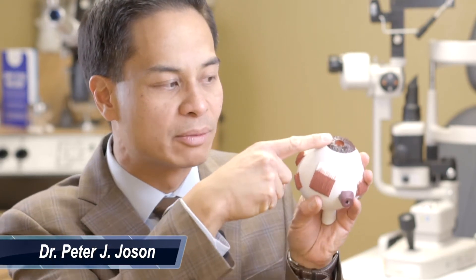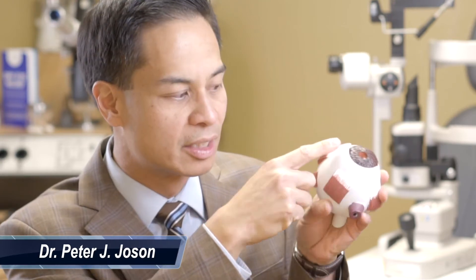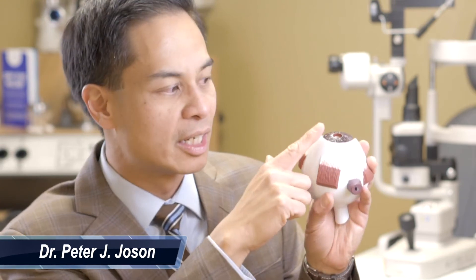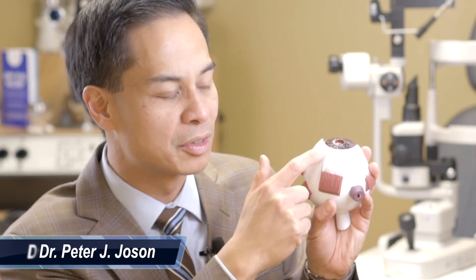During the surgery, you'll be on your back. There'll be a microscope placed over your eye to direct my vision and my hands to the appropriate techniques. The concept of the surgery is a plastic tube implant will be placed in the front of the eye, attached to a plastic plate. The plastic plate will be sewn onto the eye and the plastic tube will be secured also to the wall of the eye.